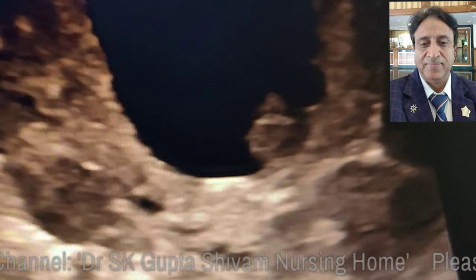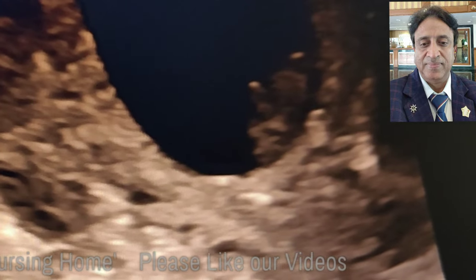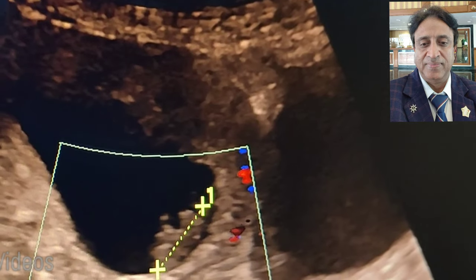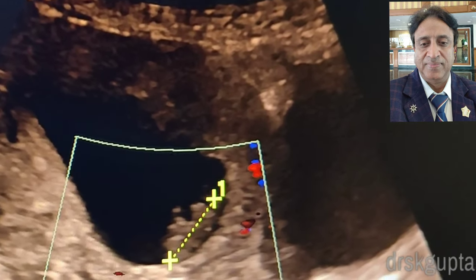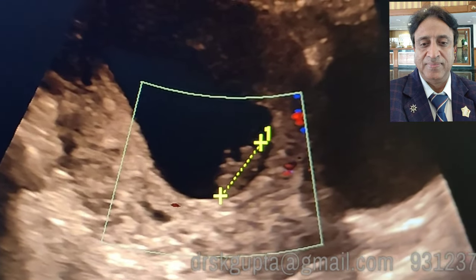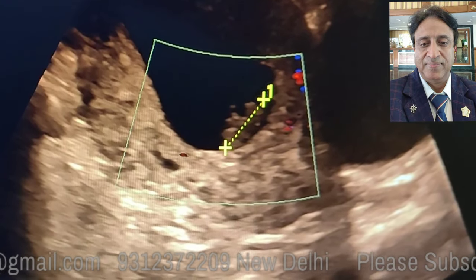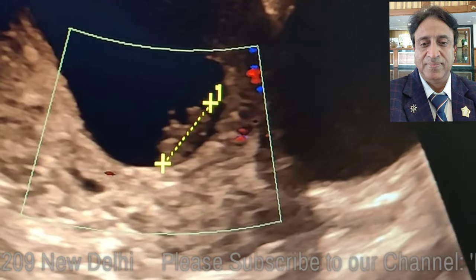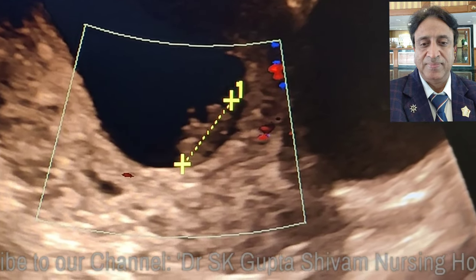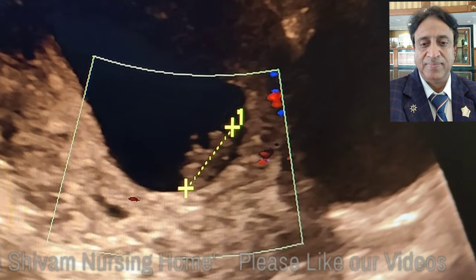Usually a fetal pole of this size — more than 16 mm — should be showing cardiac activity. But this fetal pole is not showing any cardiac activity, neither on the spectral Doppler nor on the color Doppler, which again suggests that we are dealing with a missed abortion.